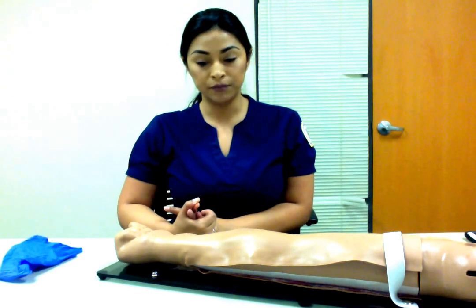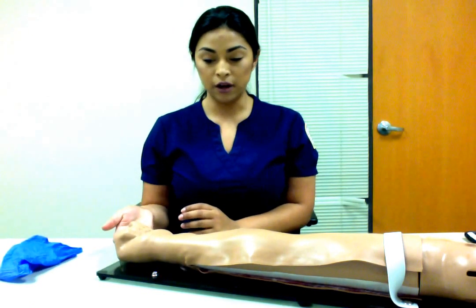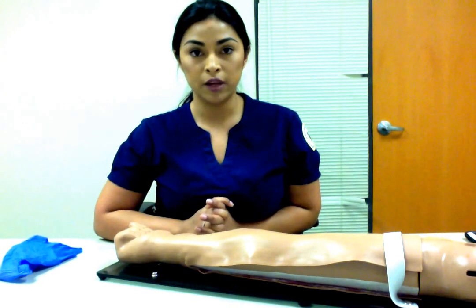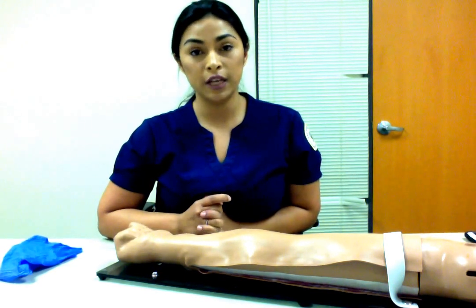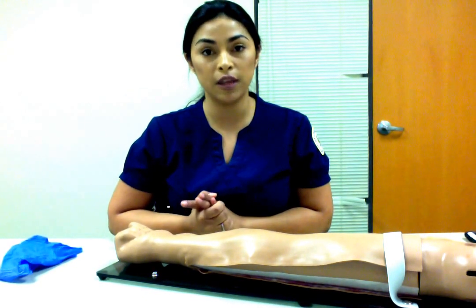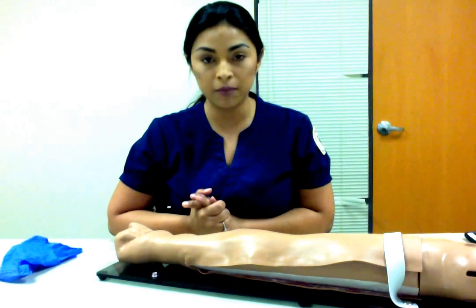Next, I would choose which arm I would want to do my blood gas on. So for this patient, I've chosen the left arm. Again, some contraindications for doing a blood gas sample would be if the patient has any arterial shunts or grafts. A good indication that you should not use that arm is if you cannot perform a blood pressure on that patient. At that point, you would choose another arm or another site to do the ABG.